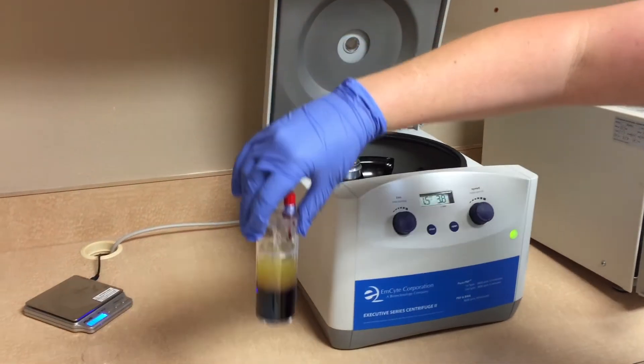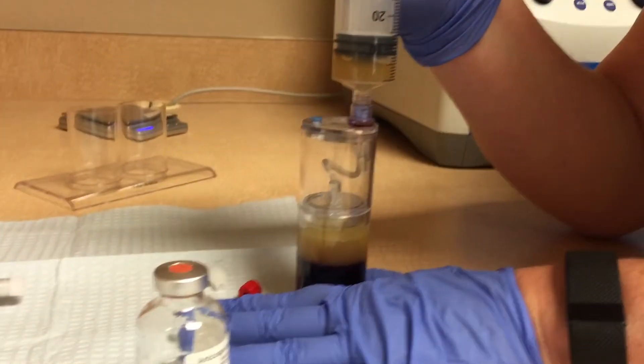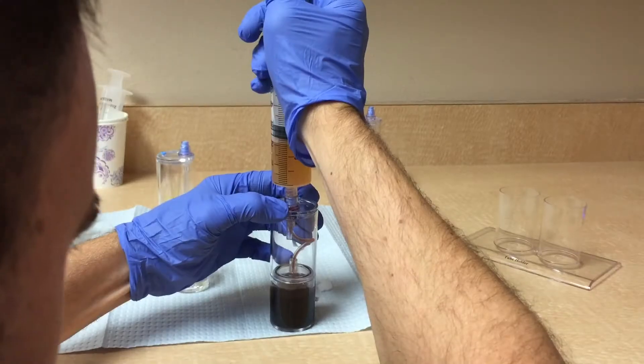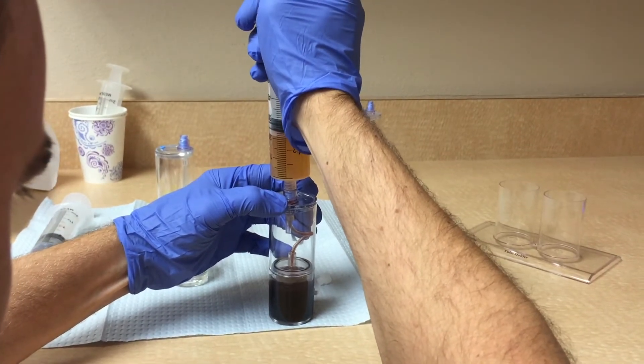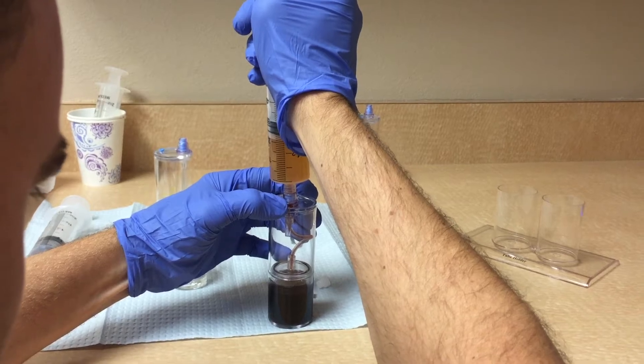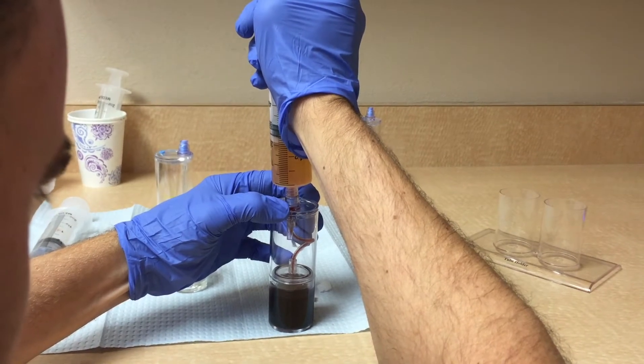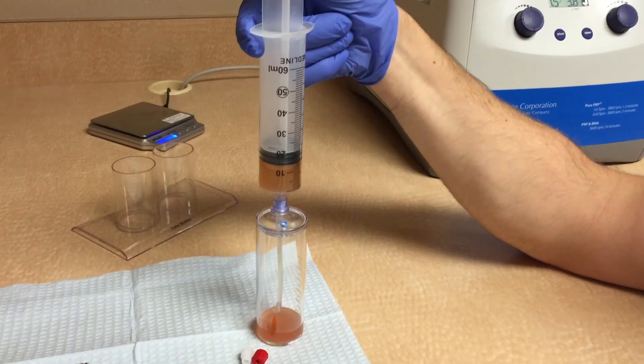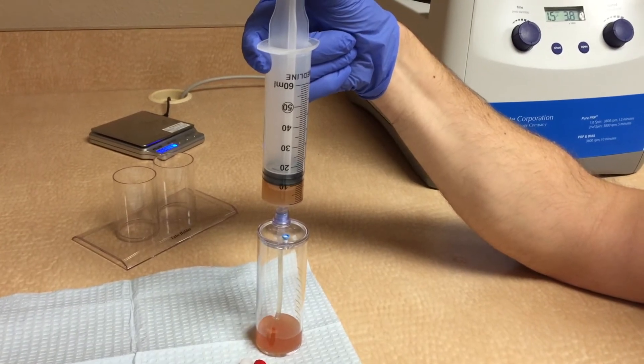First one here is EmCyte. We used this product for years. It had a double spin method compared to the Apex product. This was the most challenging portion of the processing — very hard to differentiate the buffy coat layer, and this often resulted in getting more white blood cells and red blood cells than you'd like.